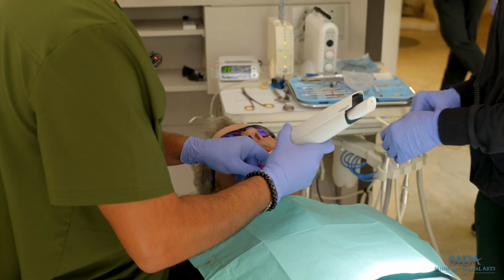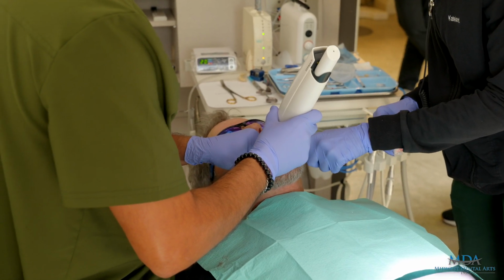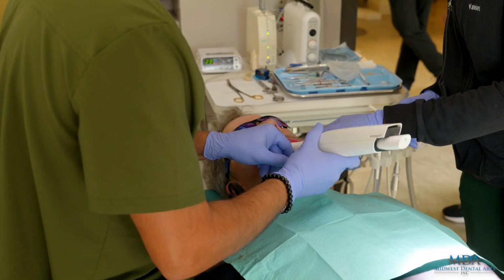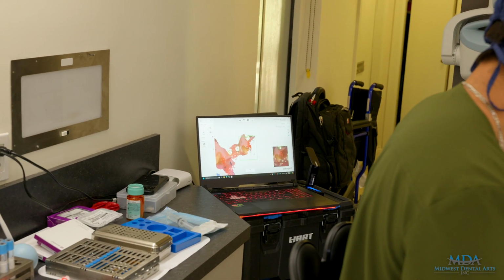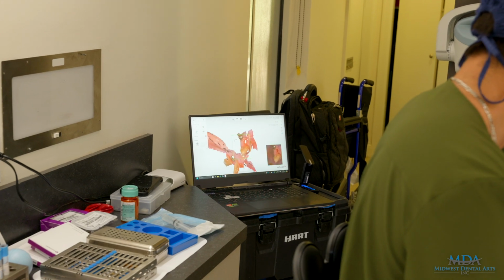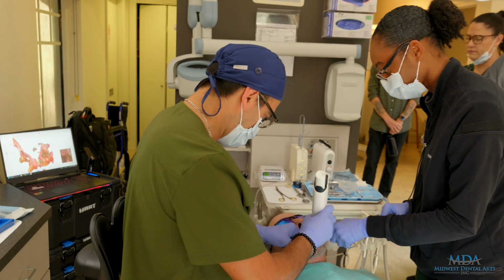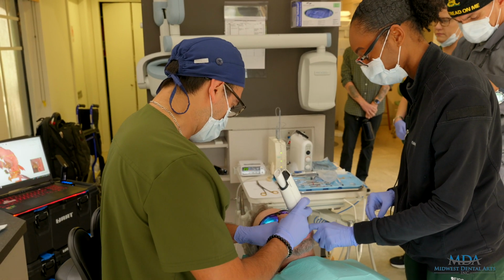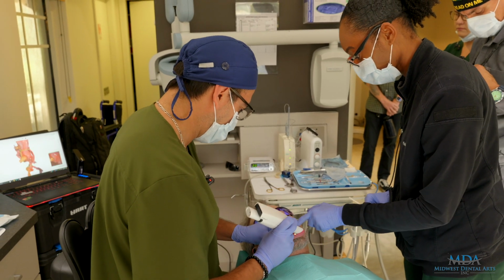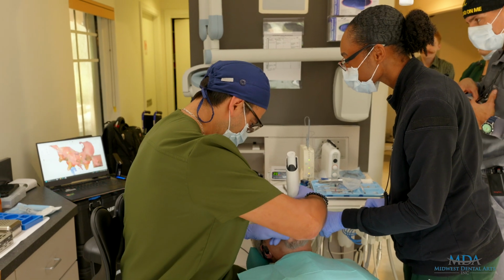Caitlin, if you can pull that side as far as you can and don't move, far down, yeah, and keep it straight so it doesn't move. Remember, any moving tissue doesn't capture, so that's actually perfect right there. And these teeth that are still in here are going to help us with our aligning process and be our markers for our final designs.